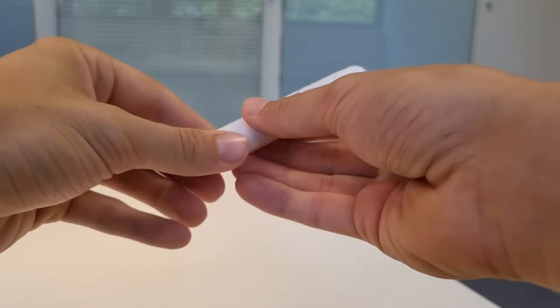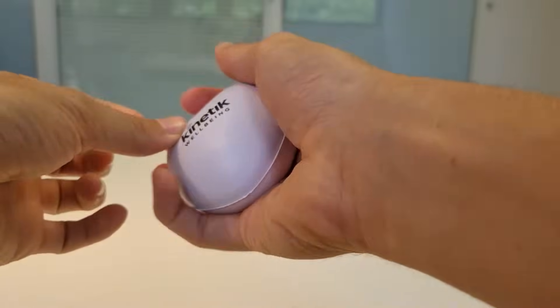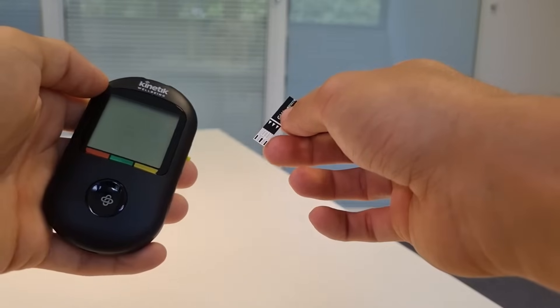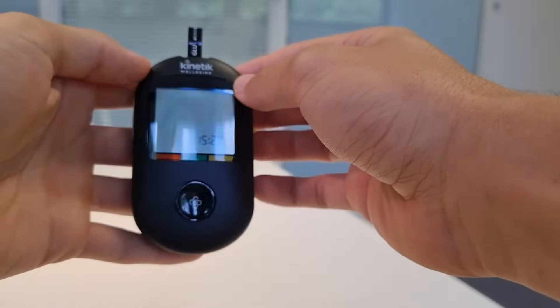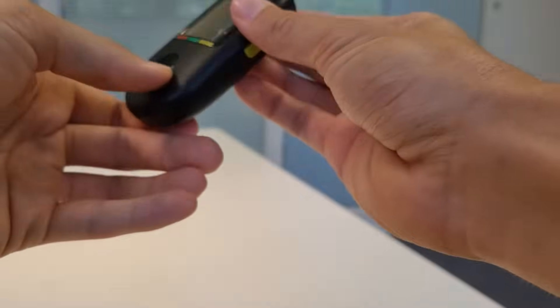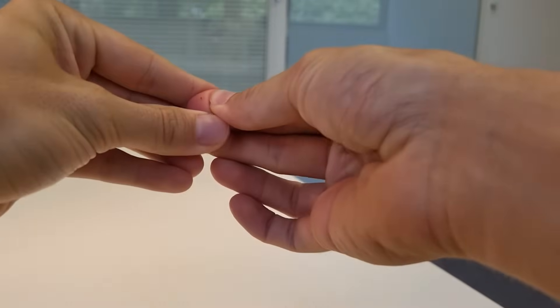Before taking the blood sample I just want to insert the test strip — in like so. The device will turn on; it knows what time it is and it knows it's looking for a blood sample. The way I like to get blood pumping into my fingers is I get a stress ball. Then I'm just going to turn the device upside down and hold it to my finger so the blood is naturally drawn up. I hold it up to my finger and then fire — that should draw blood.